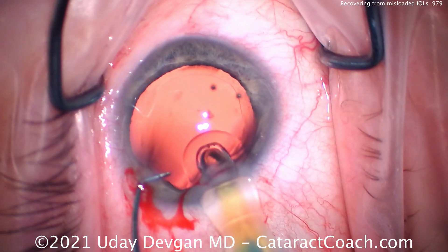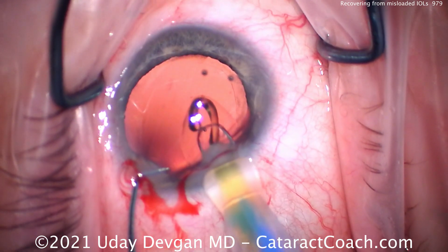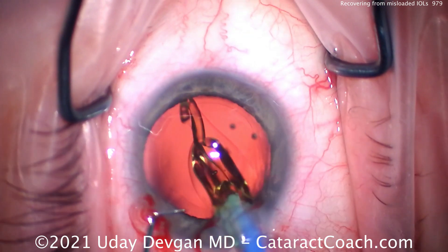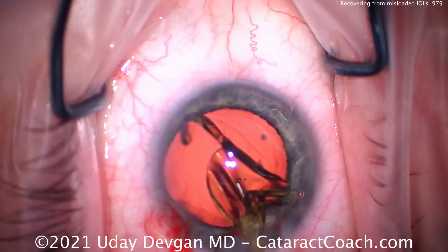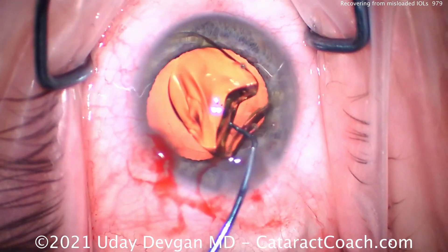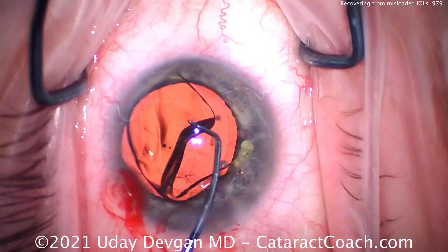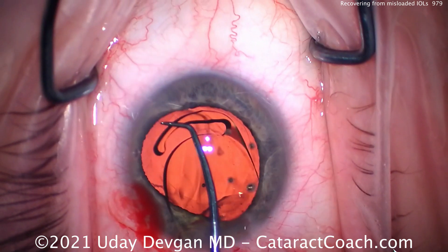So I asked the scrub tech — who's a new scrub tech — did you put enough viscoelastic to lubricate it? She said yes. So we're delivering it, going very slowly, and we push it into the eye, and what is going on here? The trailing haptic is all bunched up on top of the optic. This lens was misloaded in the injector, and as a result, it has distorted upon insertion.